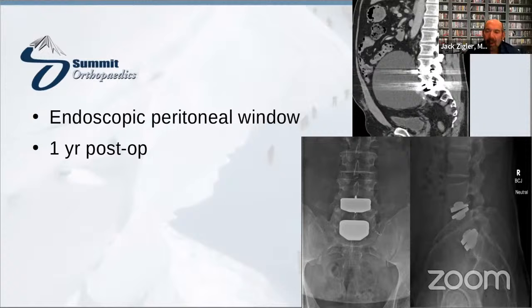Yeah, glad to hear that. Because the only time we looked at this scientifically was very early, at the end of the IDE studies, and we were unable to find a prognostic factor that influenced whether patients would get neuropraxia pain post-op. We looked at things like the amount of disc space collapse, prior surgeries, and there was just no correlation. But that study is 20 years old now, and it just involved the IDE patients. It would be nice to do that again on real world patients and find out whether we missed the boat, whether there are prognostic indicators so that we can pre-treat the right population and not over-treat everybody.